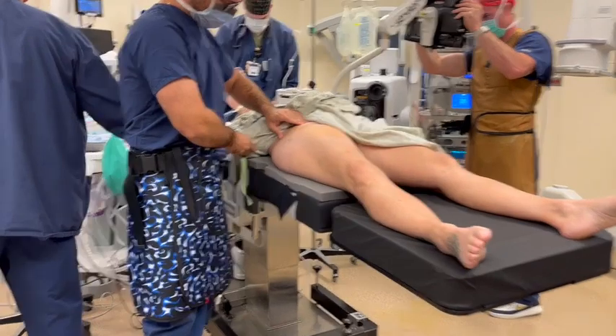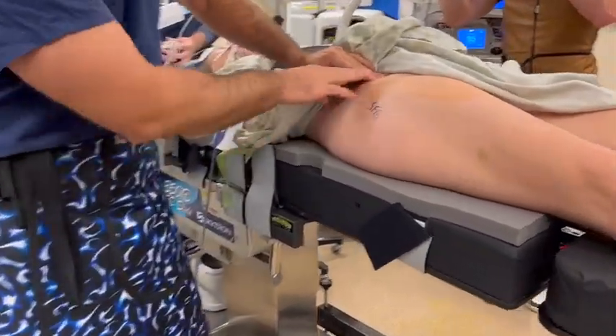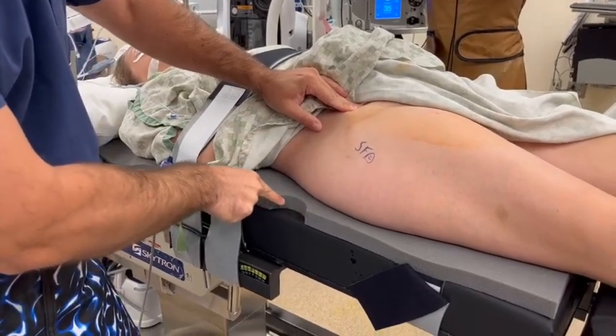Patient leg support attachment is kept in place so that the patient can aid in positioning while awake. It is important to ensure that the patient's skin directly contacts the pad with no gown or drape in between the patient and the traction pad.